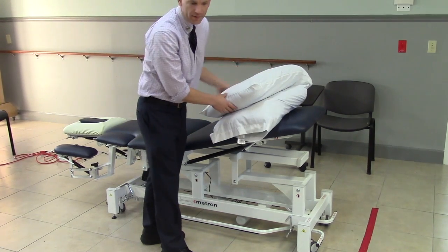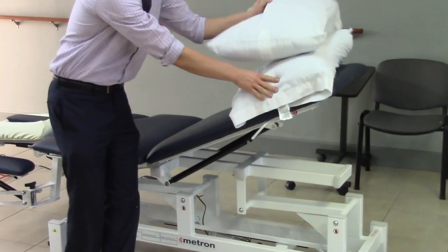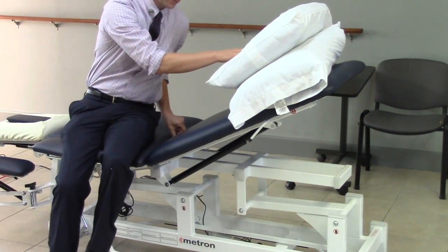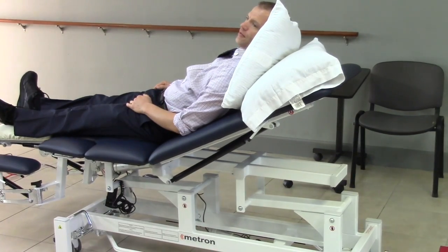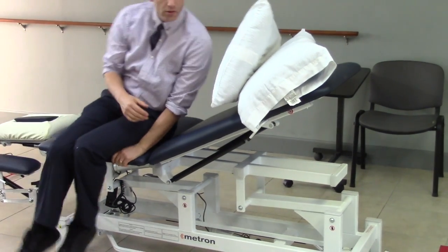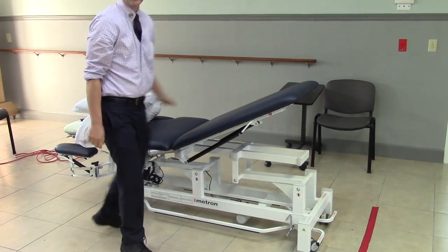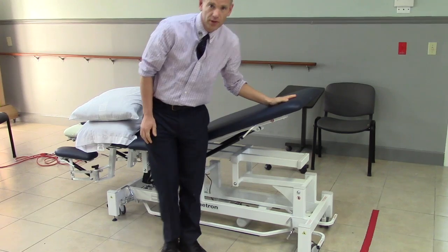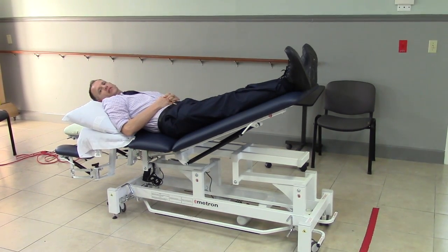You can move the pillows up, and if you want your patient in a recumbent position, simply adjust it to the height you're looking for, use pillows if you'd like, and lie them down. You can also take pillows, put them near the head, lie your patient down, and have their feet elevated.